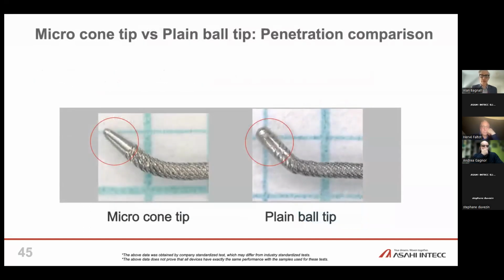And again, this is how they might look underneath a microscope. And you can see that there's really quite a difference between these. So the one on the left, this would be like your Gaia families of wires, that have got a tapered cone like this.